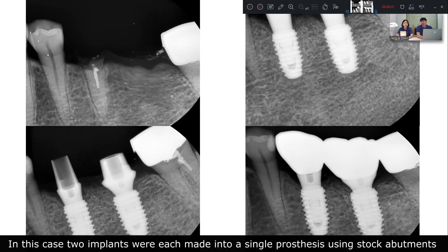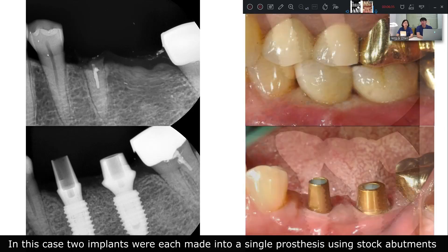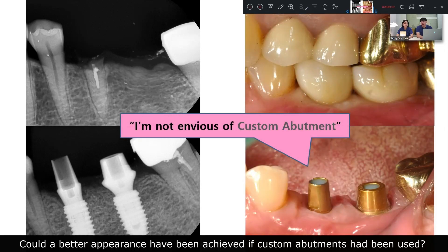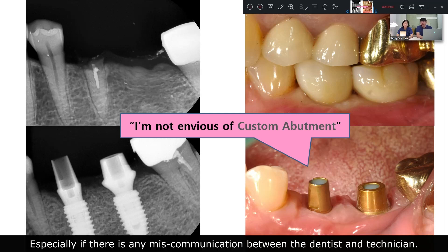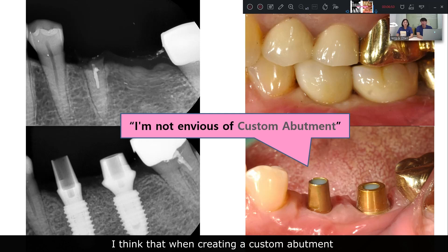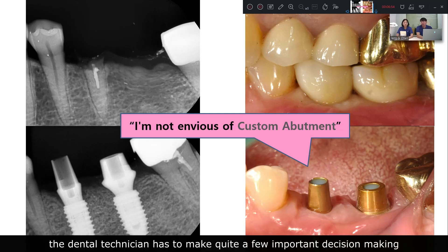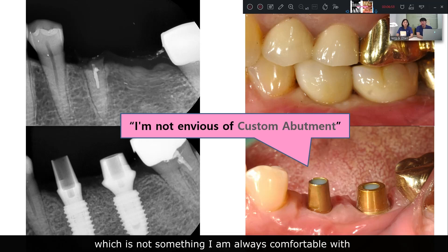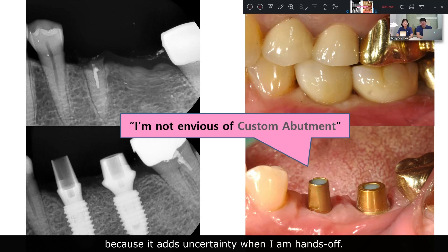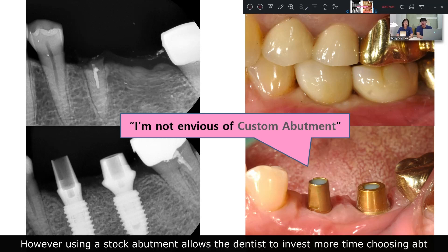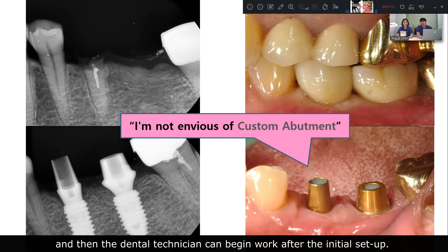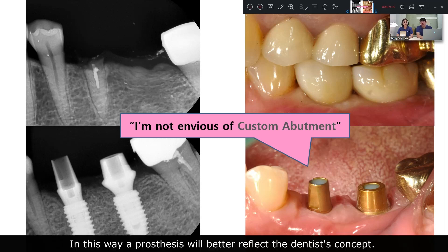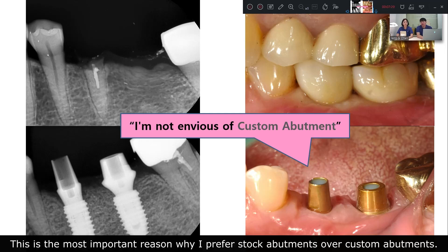In this case, two implants were each made into a single prosthesis using stock abutment. Would a better appearance have been achieved if a custom abutment had been used? I don't think so. Especially if there is any miscommunication between the dentist and the dental lab. When creating a custom abutment, the dental technician has to make quite a few important decisions, which adds uncertainty. However, using a stock abutment allows dentists to invest more time choosing the abutment, and then the dental technician can begin work after the initial setup. This way, a prosthesis will better reflect the dentist's concept, and this is the most important reason why I prefer stock abutment over custom abutment.